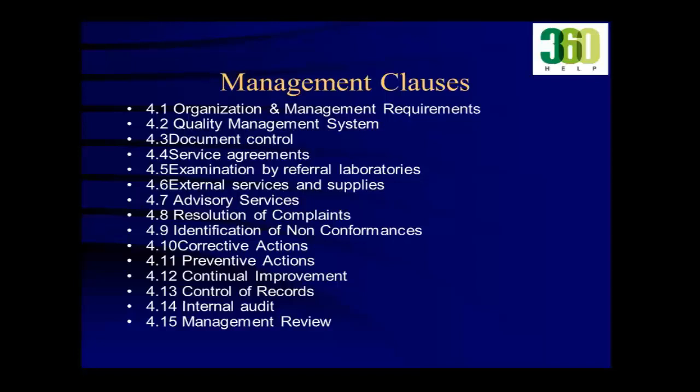Every lab has to have qualified people who can give advice to the patient or to the referring doctor. If the referring doctor wants to ask, for this particular specimen I want to go in for IHC, what IHC should I go in for? What panels do you have? What panels are you suggesting? So there should be capable people to advise about the lab.